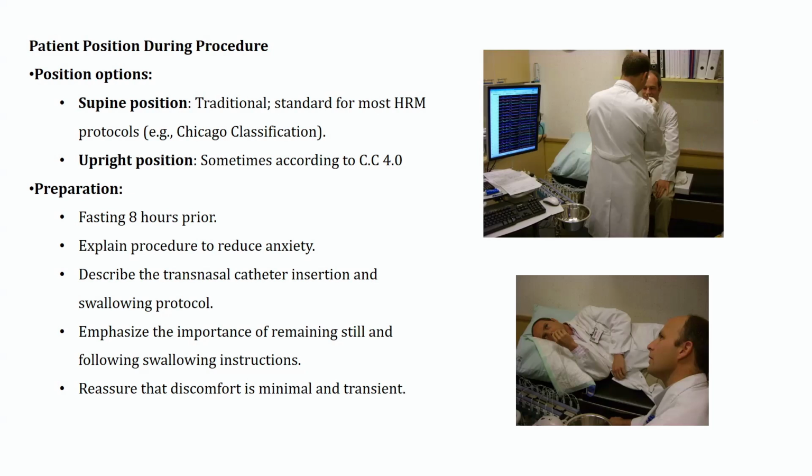Then after we insert the probe, we ask the patient to be in supine position. Why in supine position? Because it's as per the investigation protocol, it's done based on this position. And for sure, once the patient comes, he has to be prepared very well.